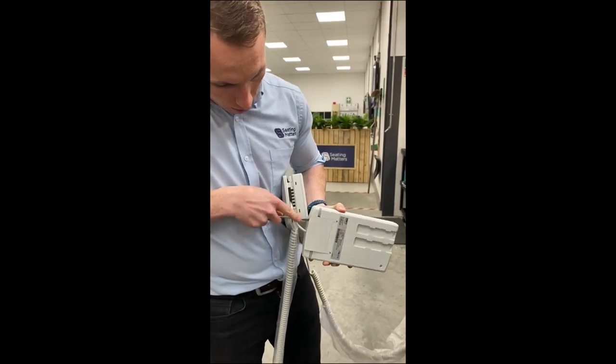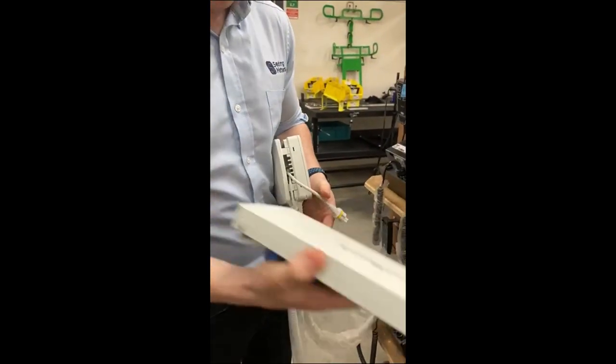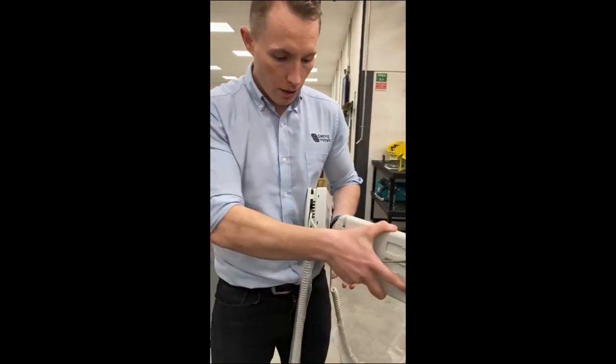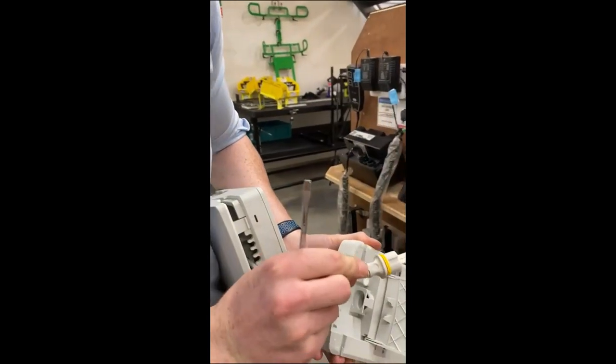There's one connection between the two that you need to open like that, and then this cable comes out. Then that battery can be replaced totally. You have the new one — this will be the reverse process.